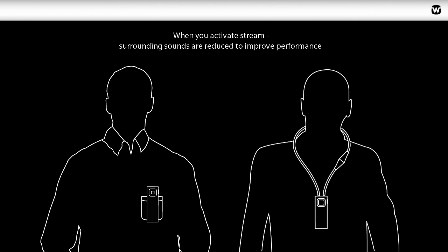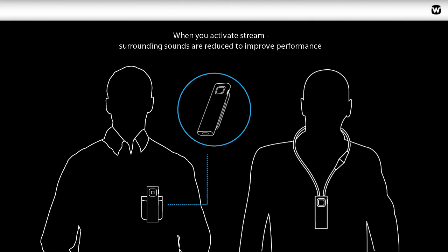For the best voice transmission, place the Remote Mic vertically with the microphone upwards on the upper part of the body.